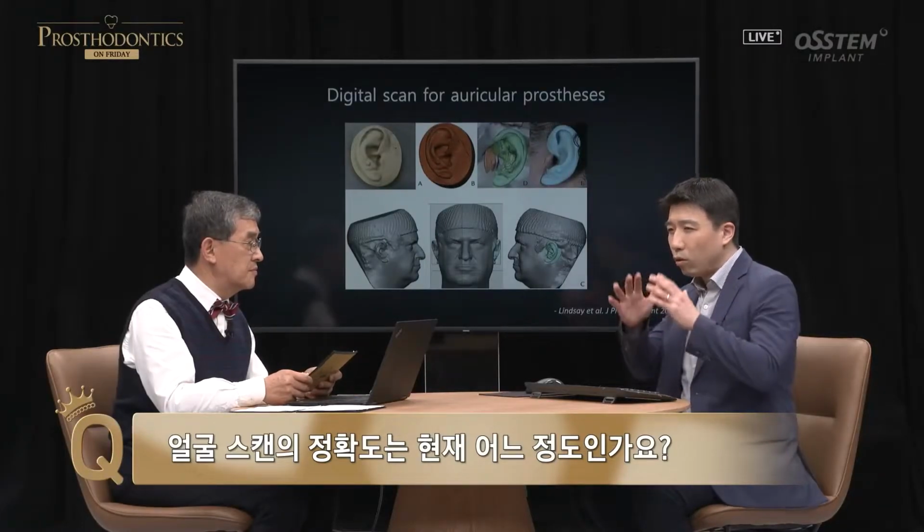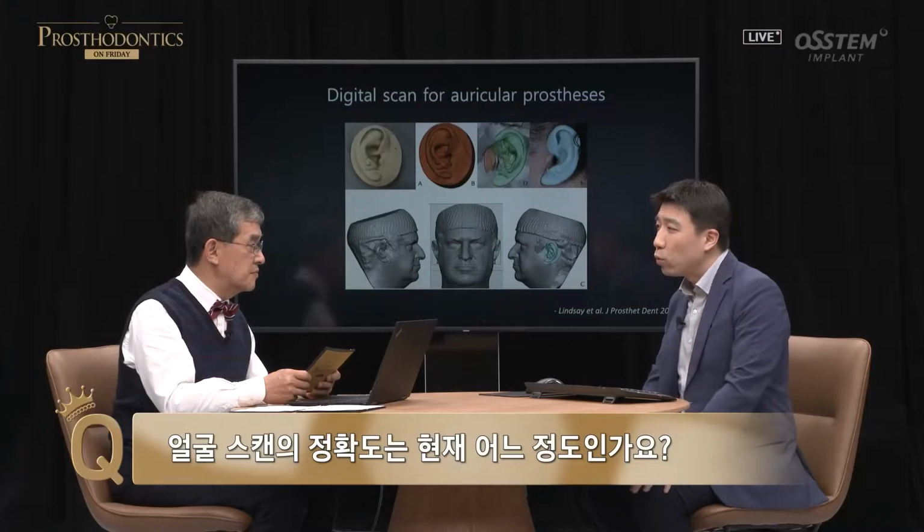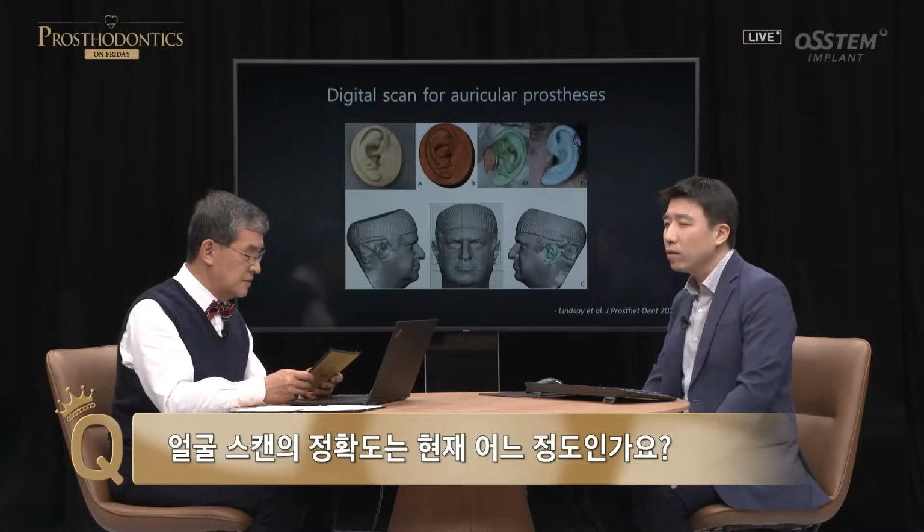Compared with oral scanner, model scanner, and scanners utilized for fabricating teeth prosthesis, the discrepancy is quite significant, yes. Personally, based on my experience, when you scan using facial model, the accuracy is quite high. When you scan face, it is actually soft tissue and it's difficult for a patient to stand in a still position until the scan is over. Because of these factors, there's discrepancy. Yes, it's because soft tissue.